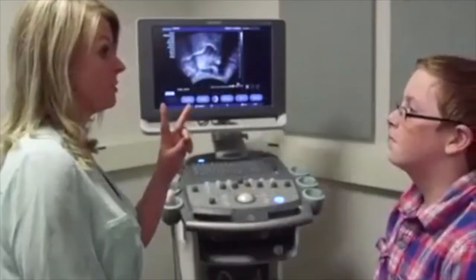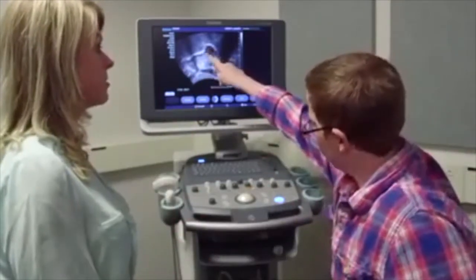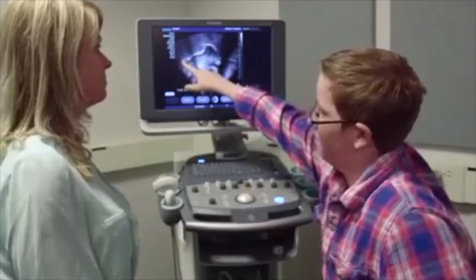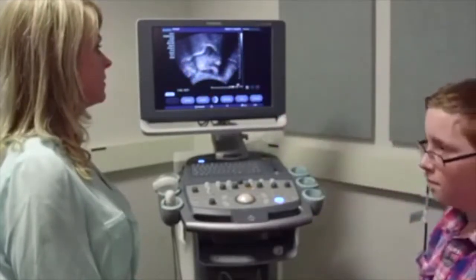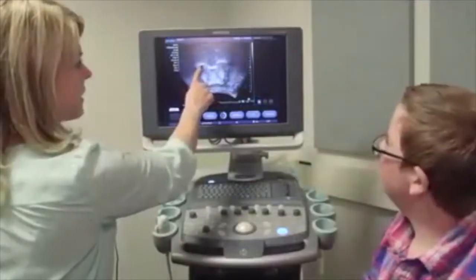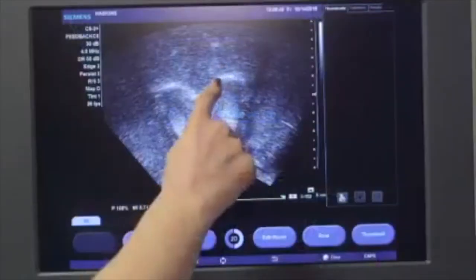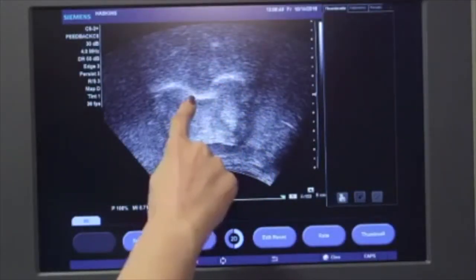Ask the participant to describe two major constrictions for R that are visible in a sagittal section. If the participant cannot identify the oral and pharyngeal constrictions just described, continue to instruct. Then, orient the participant to ultrasound images in coronal section. Instruct the participant of the desired tongue shape from left to right.